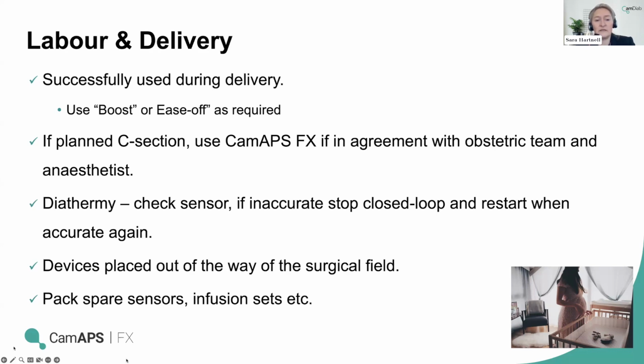If diathermy is being used, then Dexcom is not licensed for use in diathermy, so just check sensor accuracy. If you think the sensor is inaccurate, stop closed loop and then restart when you're happy with the accuracy, either if the sensor's changed or it's calibrated. And then, when you talk about settings with the women, have that conversation about making sure devices are placed outside of the surgical field, and make sure they've got spare kit with them in terms of sensors and infusion sets.